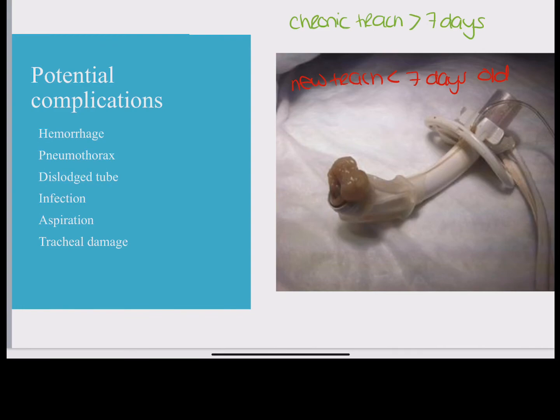If your trach tube was secured with sutures, cut those sutures off and remove that tube, because now the obturator that you have placed and taped at bedside plays an important role. To reinsert that tube, you need that obturator to guide it. Typically the obturator that came with the patient's trach will be taped to the wall or bed. This is so you can quickly grab it and reinsert the tube.